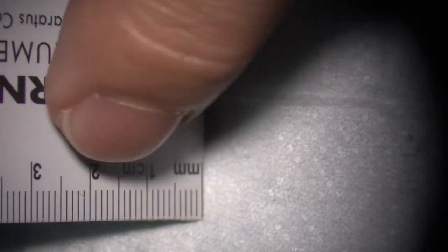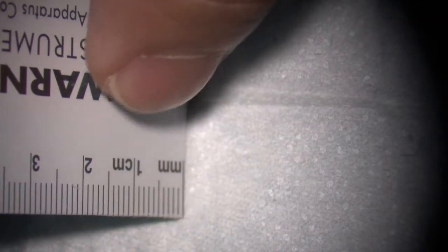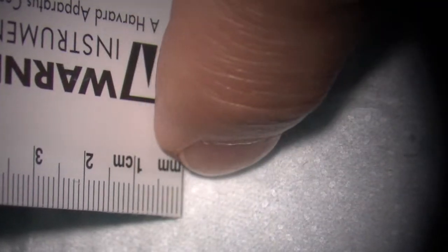Now it's 4. So the depth. Take a look, how many centimeters can we see clear? 5 centimeters. Yeah, I find here it's already blurred. So actually it's kind of big from here. It's almost up to here, 1.5, and then it starts getting blurred. So that's the depth. It's kind of like 1.5.